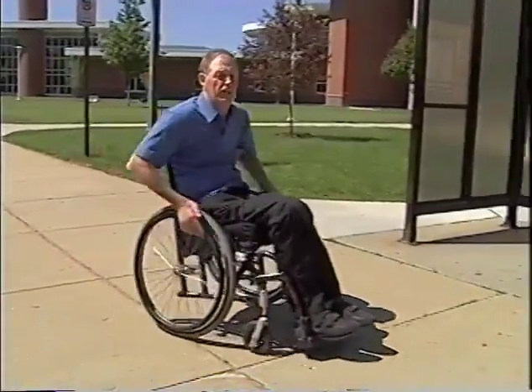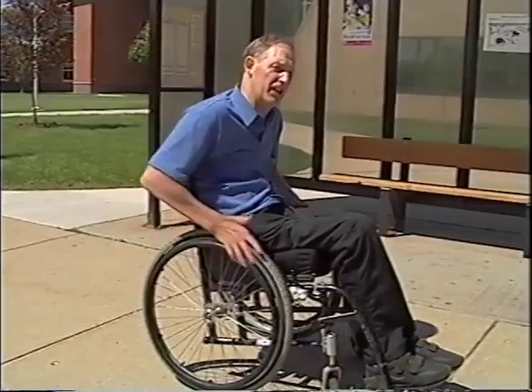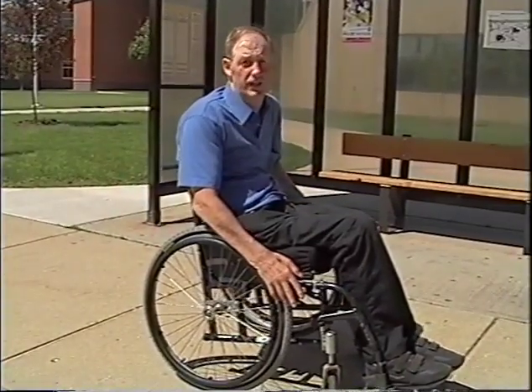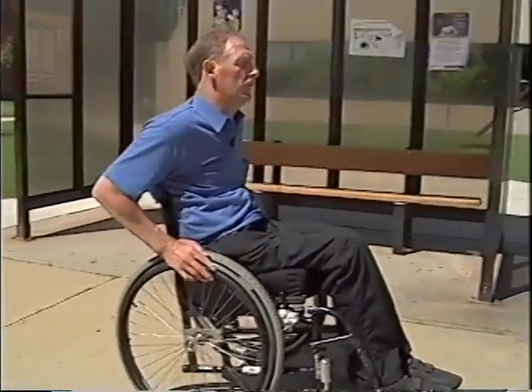It's a little more efficient to push off of something that's stable than to try to catch up with your wheel, which is already moving. You can get a better, faster push off. So it's a little more efficient. But those are the three big ways of cornering.